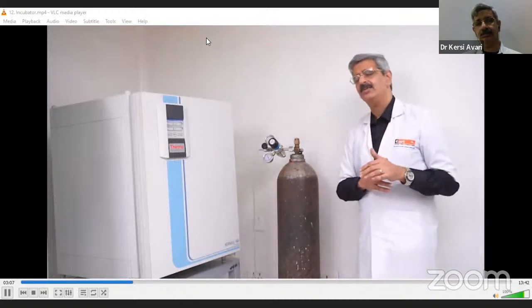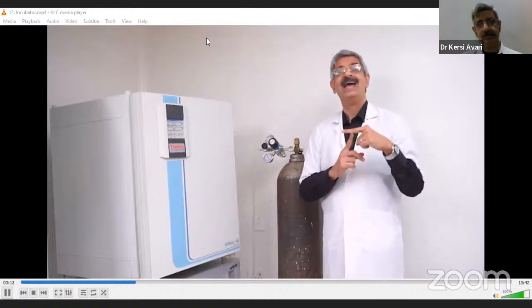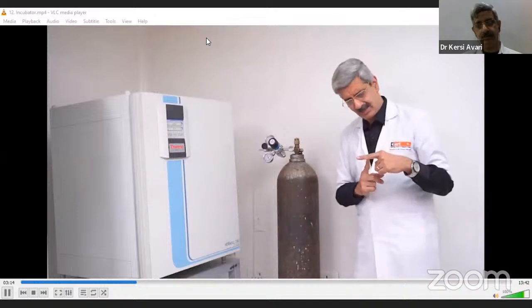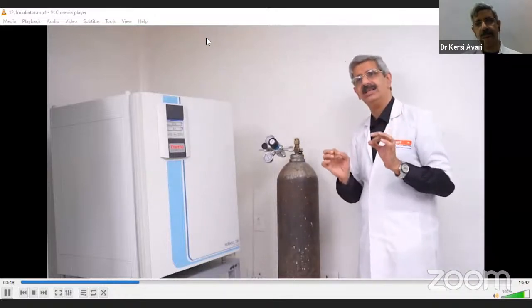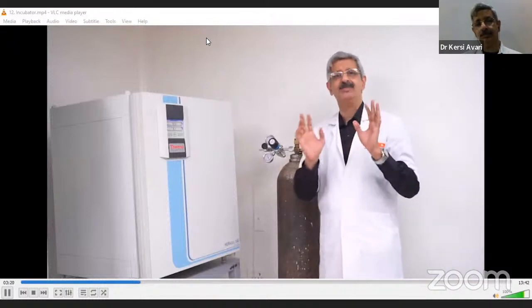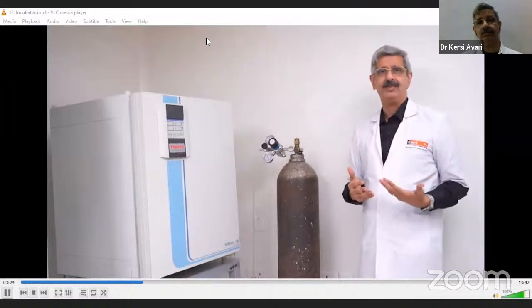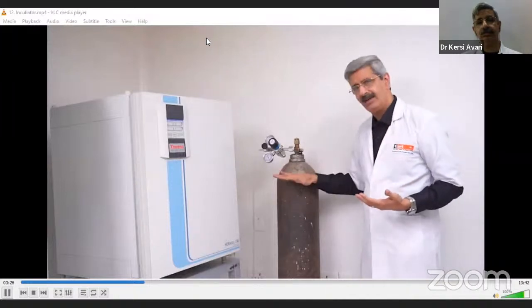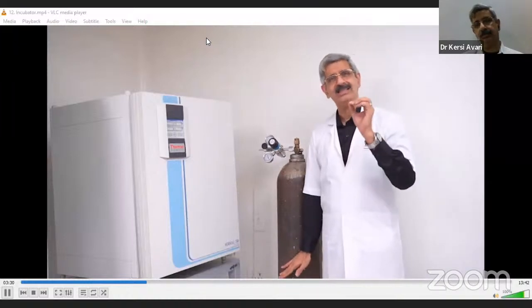And in many places we have seen that they are using those metal pipelines or the gas lines. But many times with the T's and the elbows and the joints, inadvertently a small leakage creeps in. And when it extends over a certain time frame, unfortunately the shelf life of the cylinder goes down and down, because micro leaks are not detected all that easily.